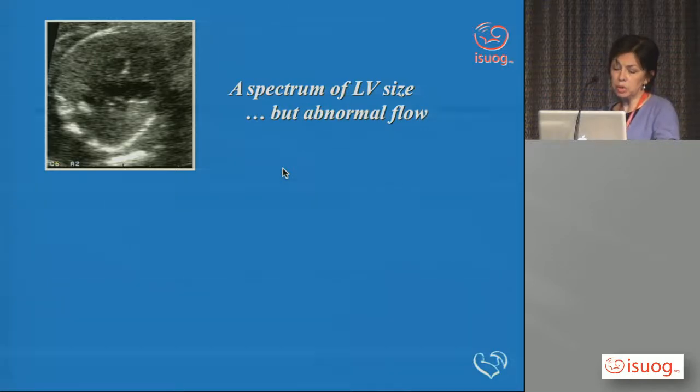And coming back to the point that not all the time the image will be excellent, and no excuse here because my pictures are not as good as the German pictures, but I try to put pictures that are actually difficult because we don't always get just the beautiful pictures. But if you imagine this lady as having high BMI, and if you manage to get that, and you say, well, you can see 2 ventricles here, you could potentially, in a busy clinic, say, okay, it's a difficult patient to scan.